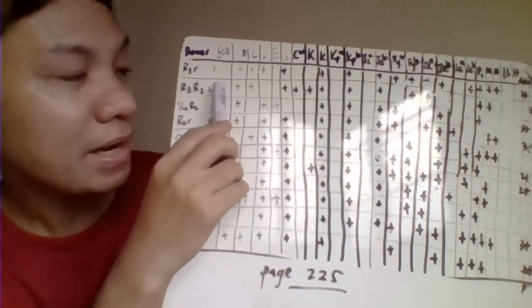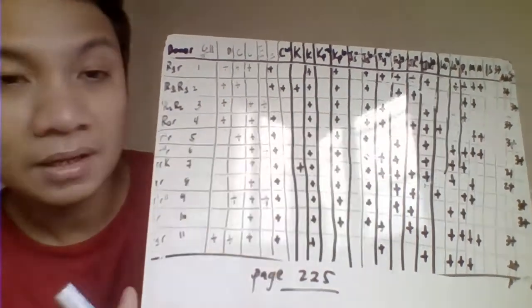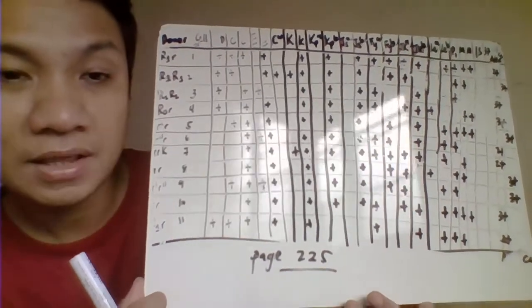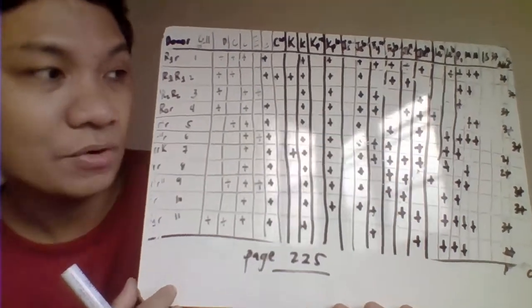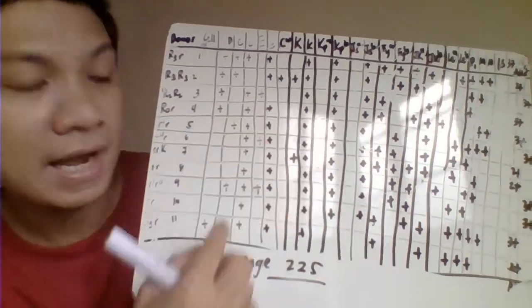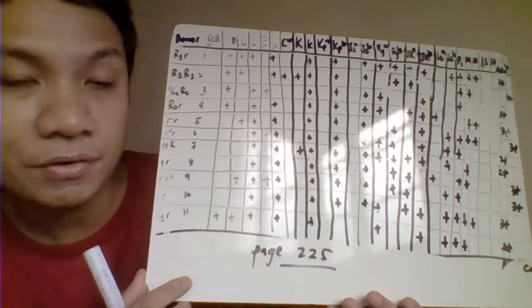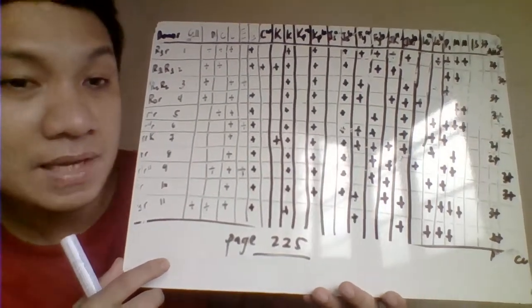Another one, your panel cell number 2, is the second vial. Each of those contains specific antigens. Therefore, you will use several panel cells in order to rule out whatever antibody is present in our patient sample.